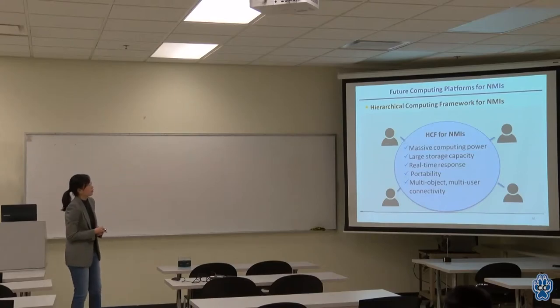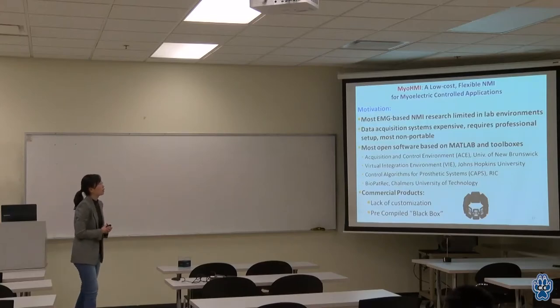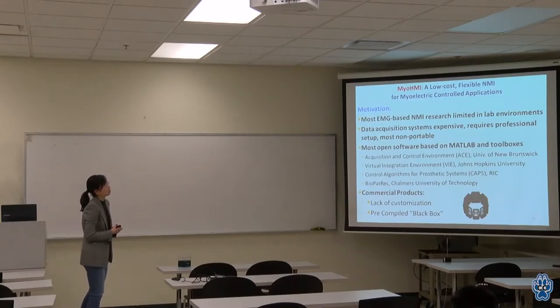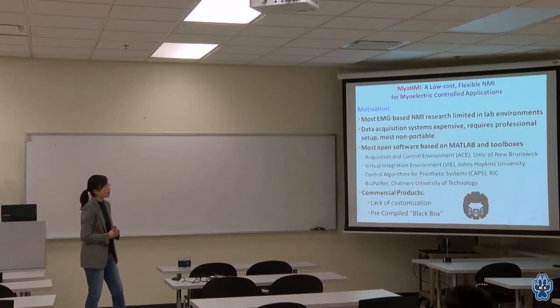So this is our goal. So based on that, right now, we have been working on a platform called MyoHMI. It is a low-cost and flexible research platform. The purpose of developing this platform is to provide a research platform that can be used by many researchers in this field to try out different algorithms, but also can achieve this portability and real-time response.